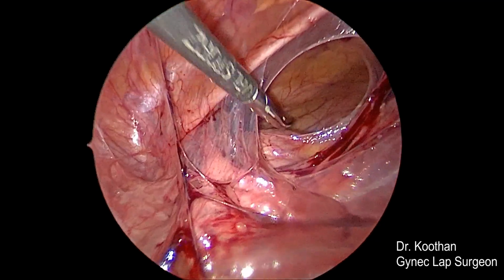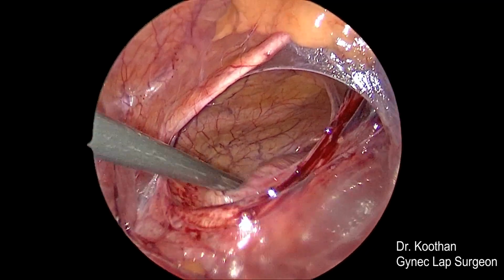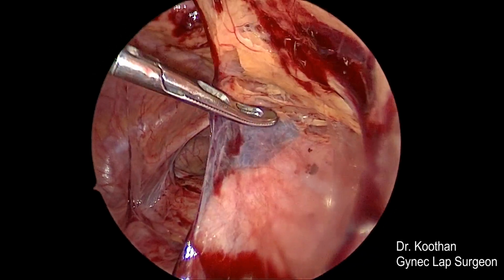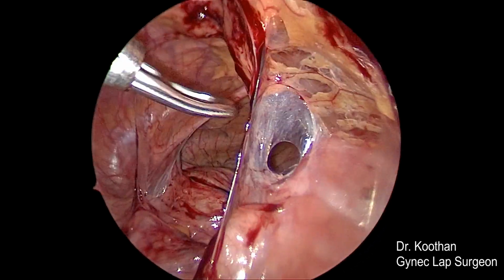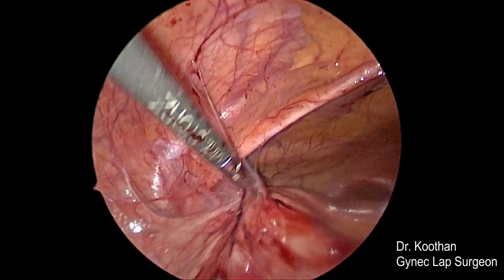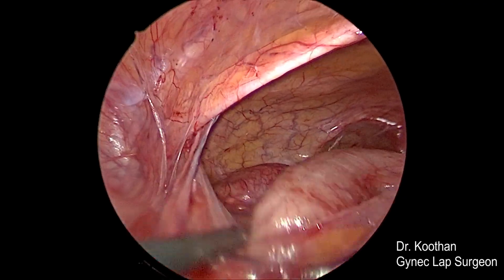Now we have started dissecting with only one secondary trocar. Now what you are seeing is the sigmoid, which is adherent to the anterior abdominal wall. This is all small intestine. So we have just started releasing the intestinal loops so that we can see the pelvis.